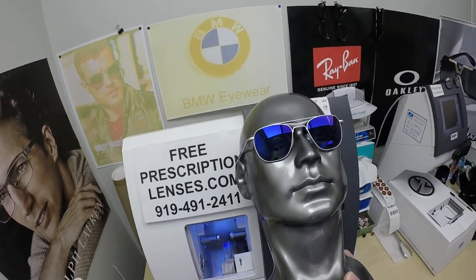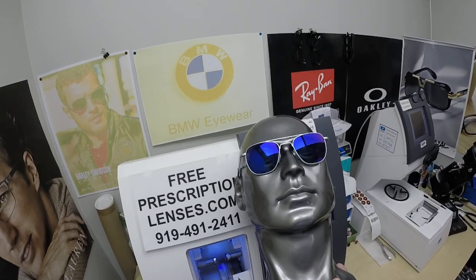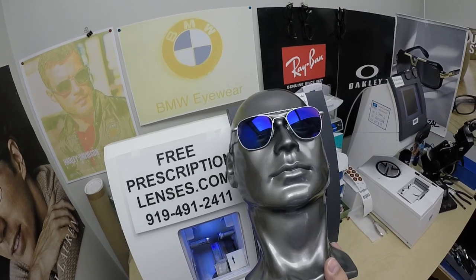I can do these in any prescription: single vision, line-style bifocal, invisible bifocal — also known as progressive, or no-line multifocal. It goes by many names.